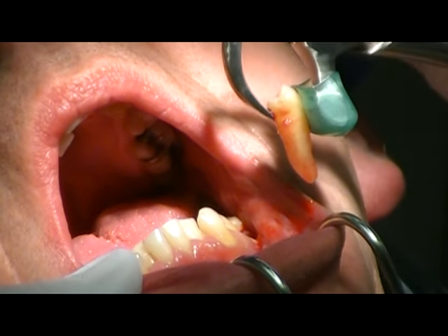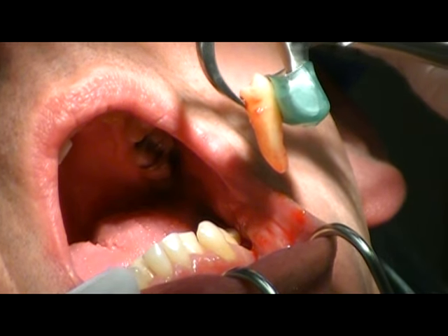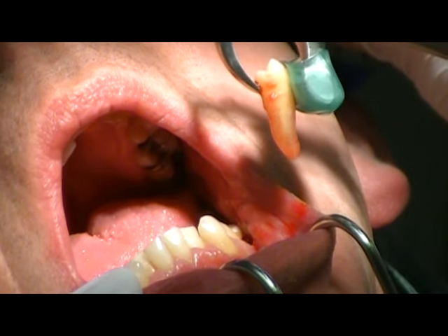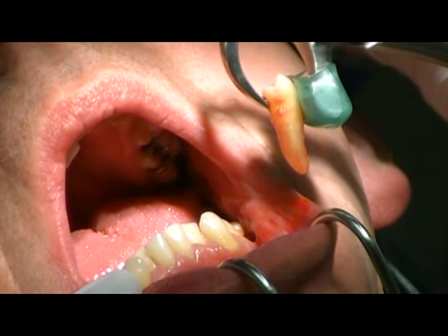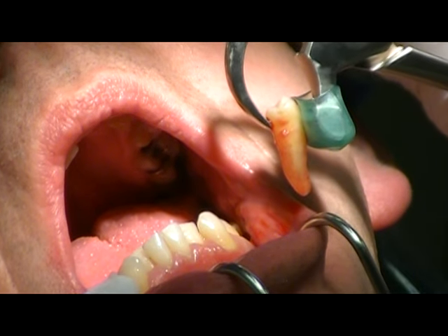So we just took a tooth out that's very long on a mature person with very, very little effort — no arm strength at all, a simple rotation. The key to success is taking your time. It may take a minute or two using the physics forcep to remove the tooth, but it's as atraumatic as you could possibly get.